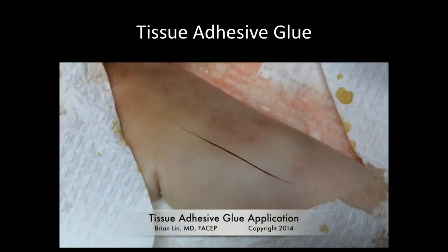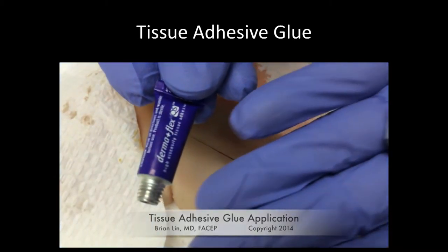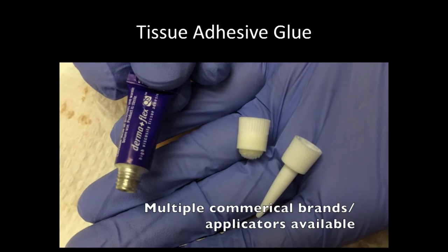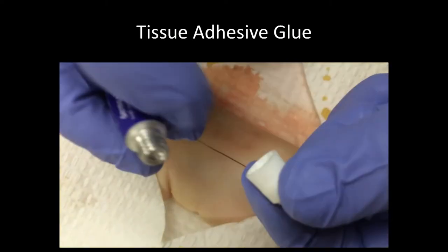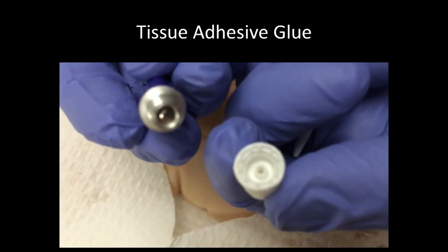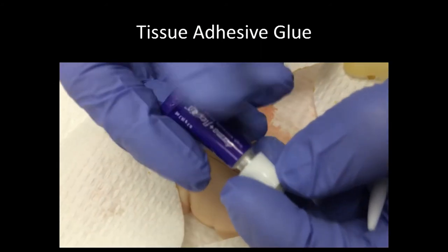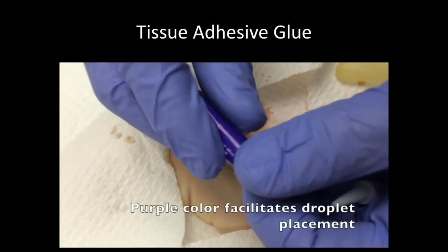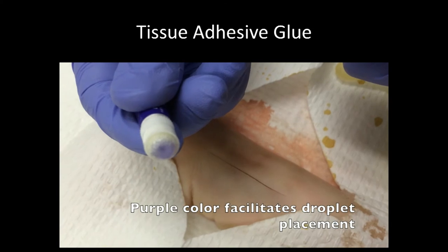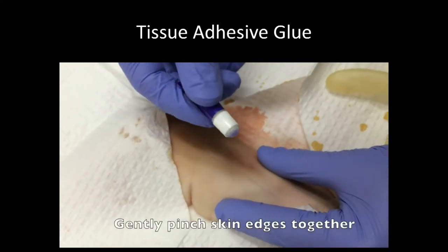Here's an example of tissue adhesive glue application as used at my institution. We're using a product called Dermaflex, but again, there are many different commercial brands and applicators available. Here you see 2 different heads you can apply, and by screwing that top onto the tube of the Dermaflex, it pierces the tube, and you see the purple-colored tissue adhesive glue at the applicator surface. That purple color is going to facilitate droplet placement.